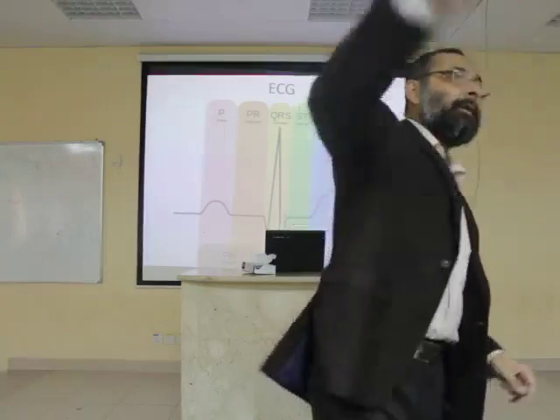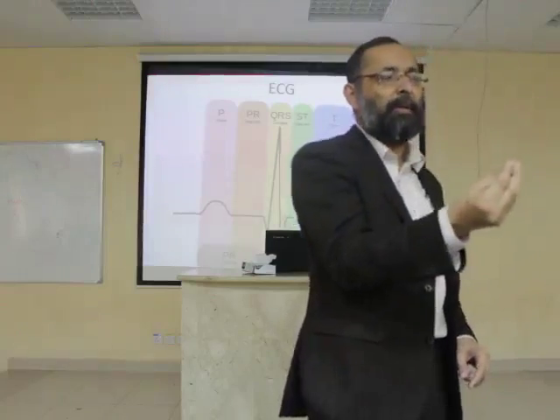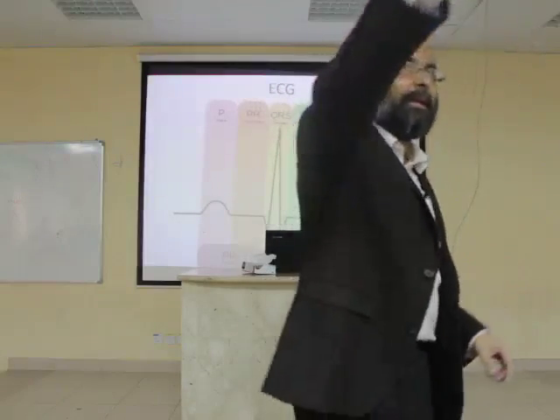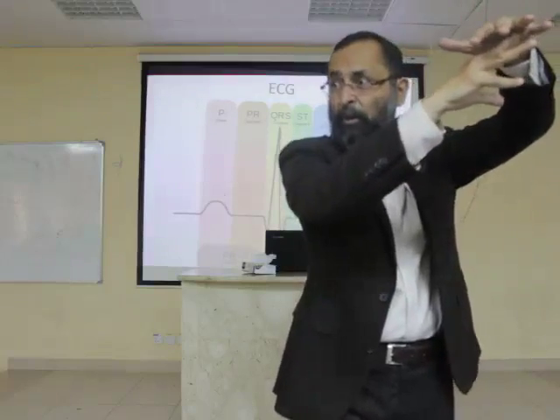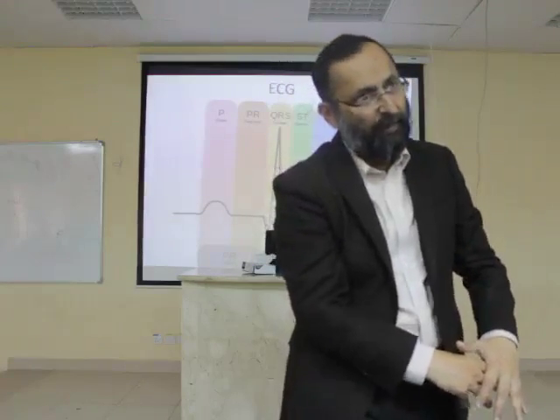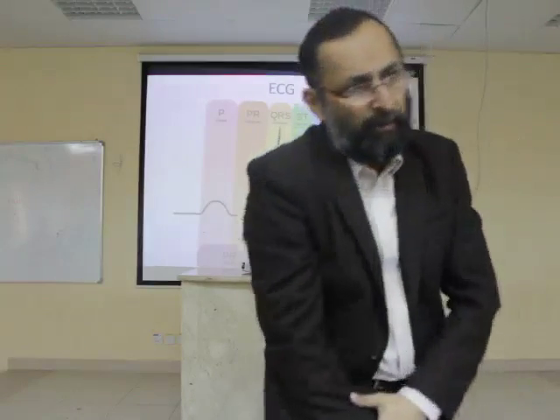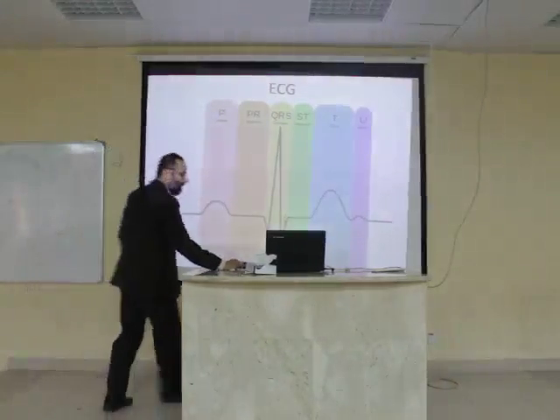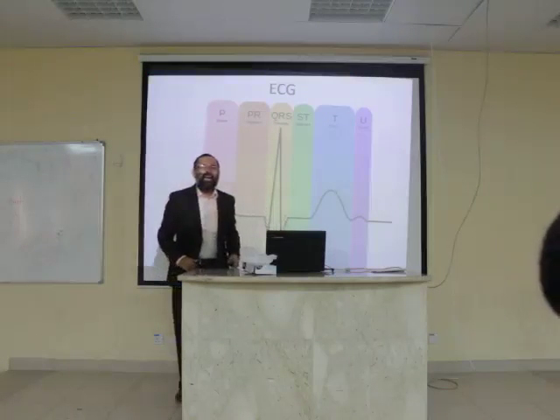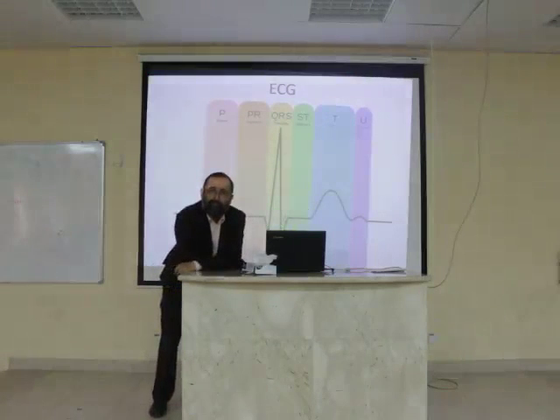If the direction is towards, remember the basic principle: if your electrical impulse in the recording system is moving close or towards your electrode, you will record a positive wave. If it is moving away, you will record negative. Okay? With this principle, what do you see unusual in this one?